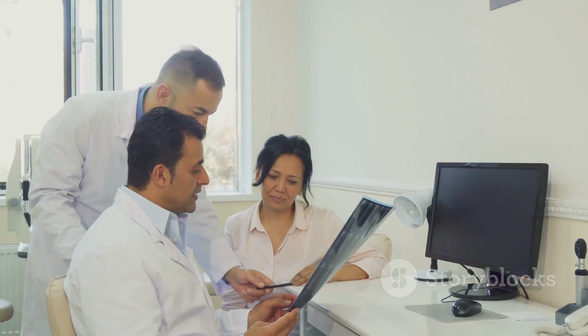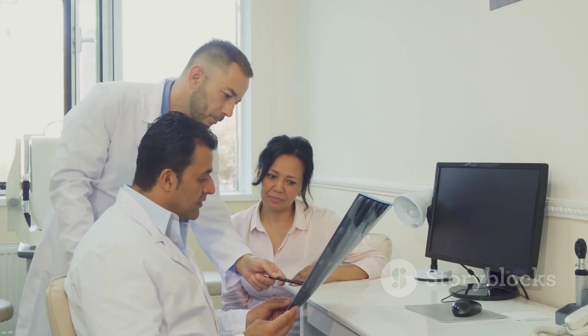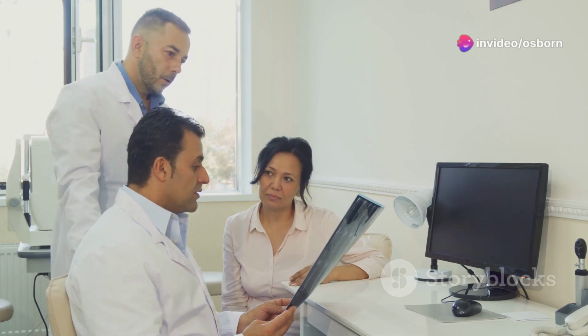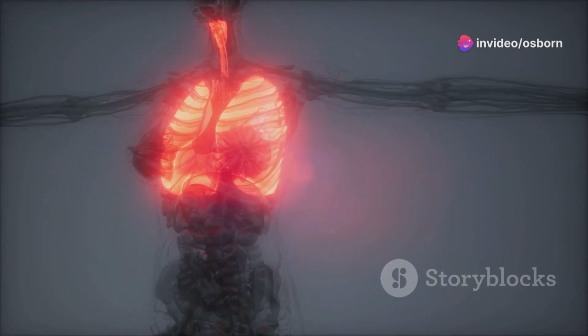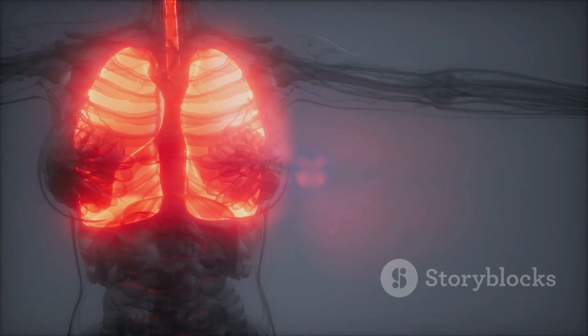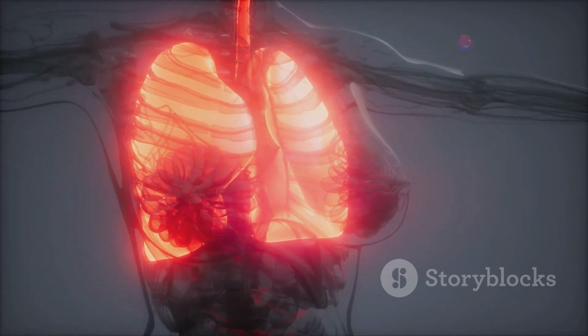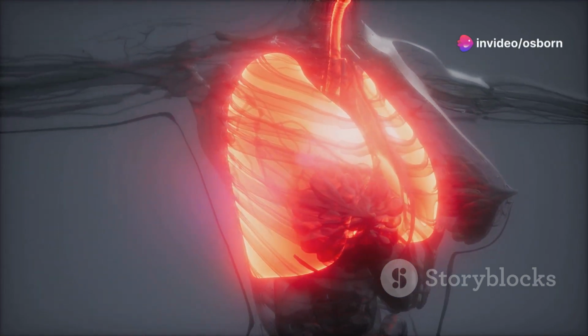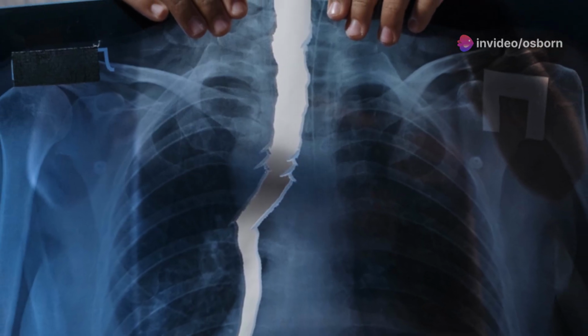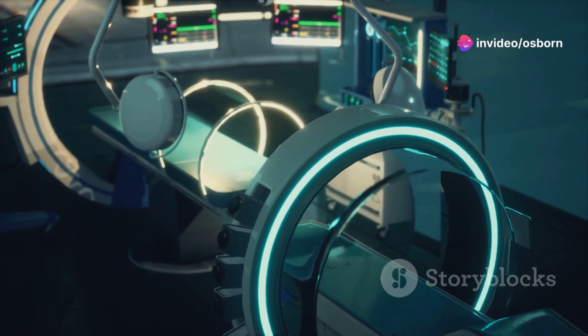In conclusion, the evolution of dose calculation methods from PDD-centric approaches to TAR, TPR, and Monte Carlo simulations has revolutionized the precision of radiation therapy. By accurately accounting for the complexities of radiation interactions and patient anatomy, these techniques have enabled the delivery of highly conformal dose distributions, maximizing tumor control while minimizing the impact on healthy tissues. This precision has translated into improved patient outcomes, including increased survival rates, reduced side effects, and enhanced quality of life.